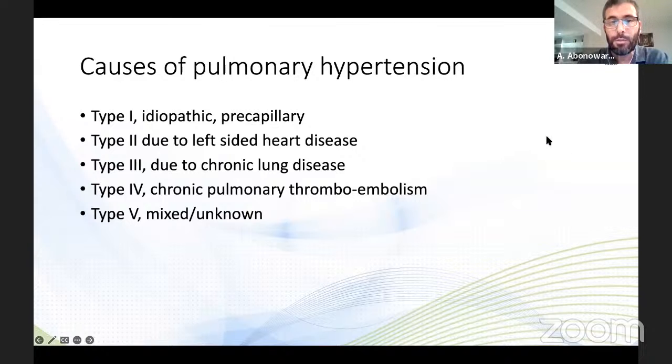You'll find the wedge easily if you take time and don't stick to one point. Don't stick to one area, then start pushing and pushing. No, just move. If you can't find it there, move to the other area, and you'll be able to. Sometimes if it's really difficult, you change the catheter. That's another thing that might help if it takes time and the catheter becomes soft. So just use cold saline or change it.